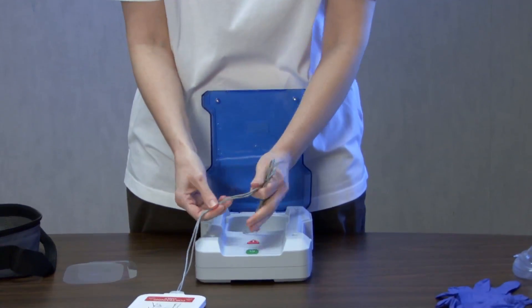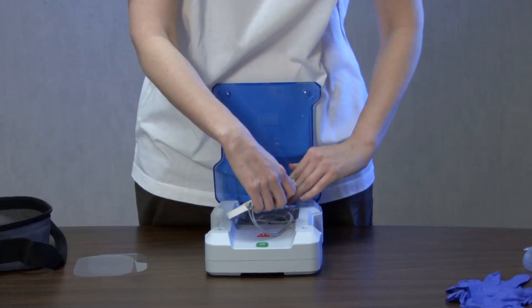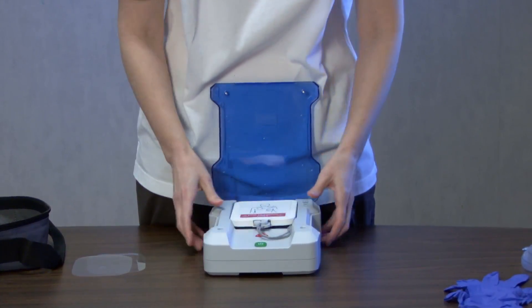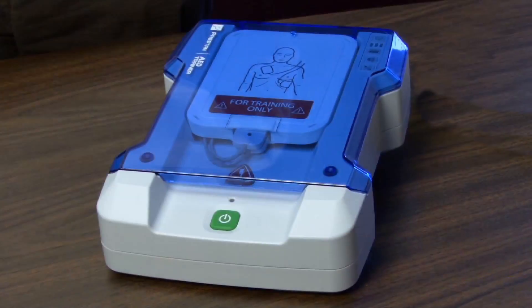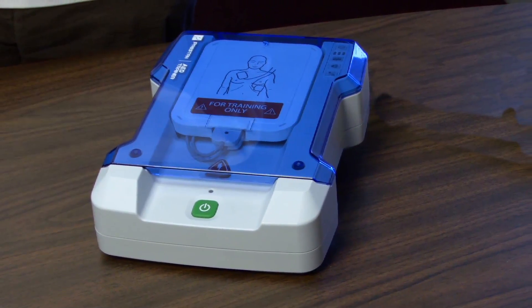Coil the cables, leaving a small loop where the cables connect to the training pad case. Place the cables in the well of the unit and cover them with the pad case. Close the unit's blue flip-top lid and your Preston Professional AED Trainer is ready for use.